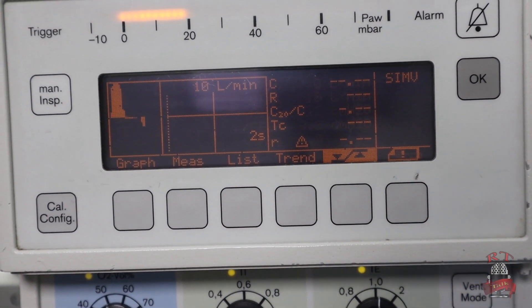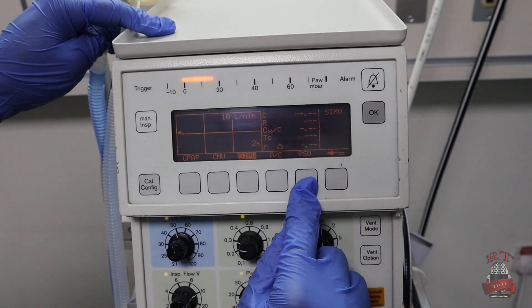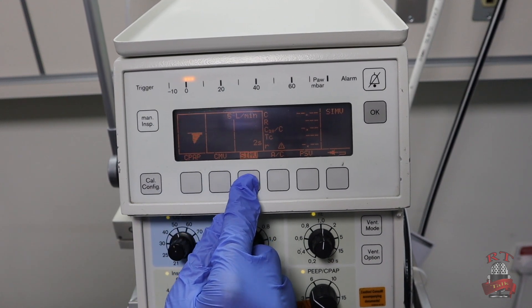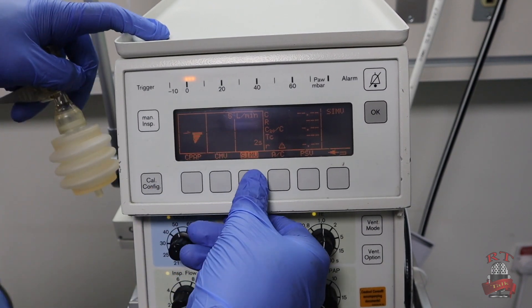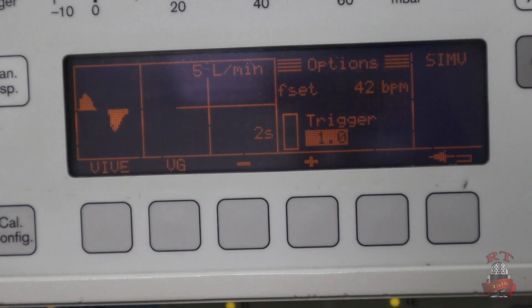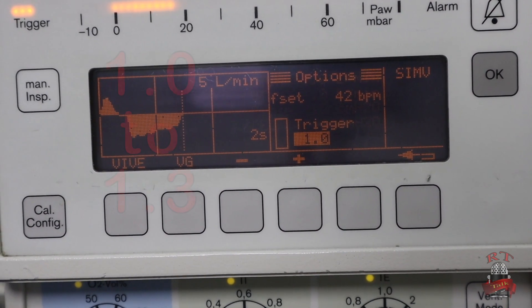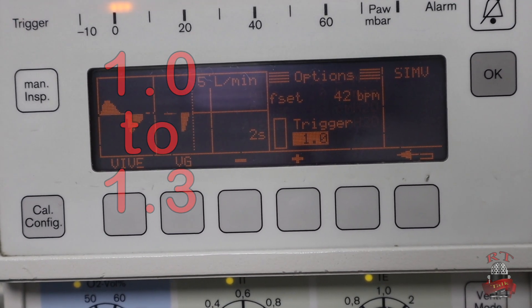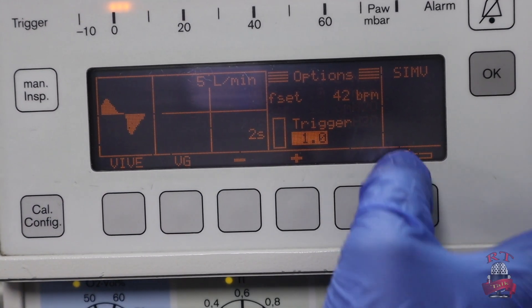Now I will go to Vent Mode to choose the mode I want. We have CPAP, CMV, SIMV, assist control, and pressure support ventilation. For today I will start with SIMV. Then we have the trigger — the sensitivity for the patient or the neonate. You will set it from 1.0 up to 1.3 — this is your range for the trigger. For me today I will keep it at 1.0, then I will press back.